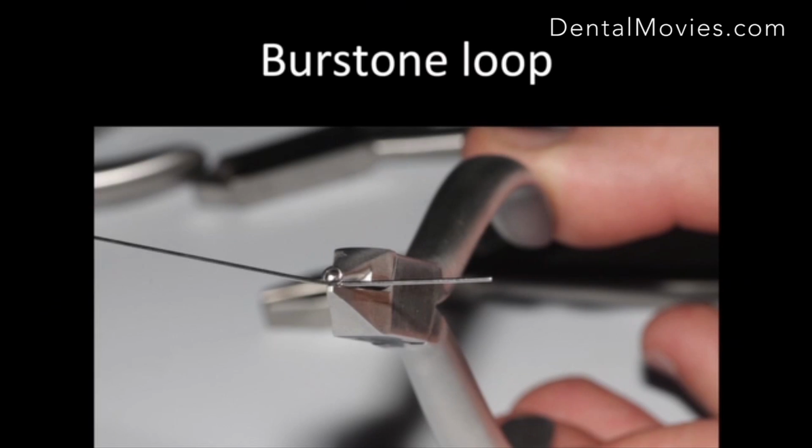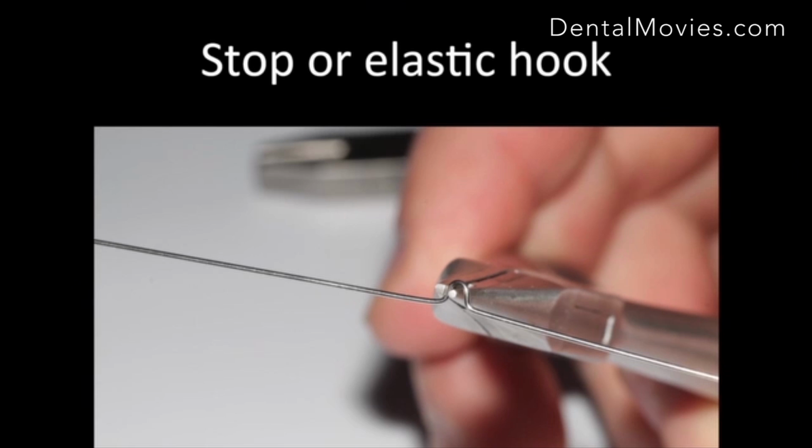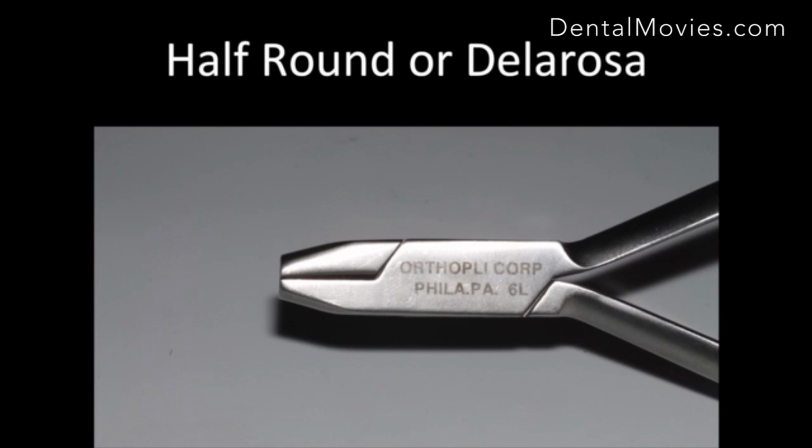What do we use it for? Burstone loops, and I've shown you how to do this, and there's a video on this that Jane has for you. Where's my friend Pavinda? Pavinda, was it you that I said you need to stop on your 2x4 case and take your ease out? That's how you do it. You understand? If you want to run elastics and you don't have a crimpable hook plier and you're on TMA, you can put a little loop in, so it's a universal loop bending plier.